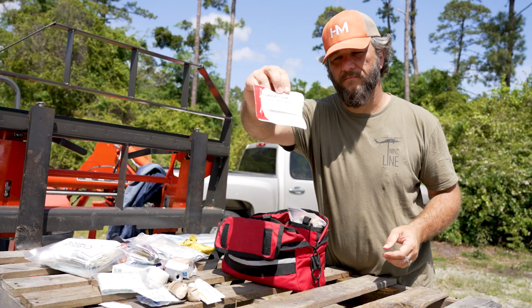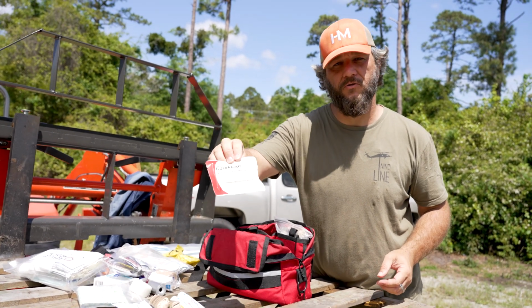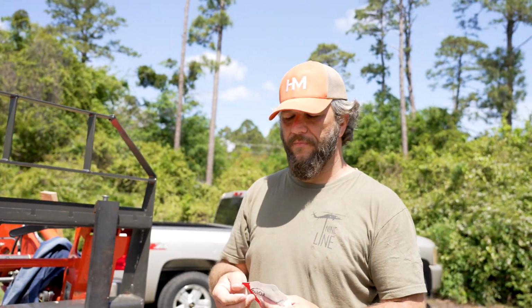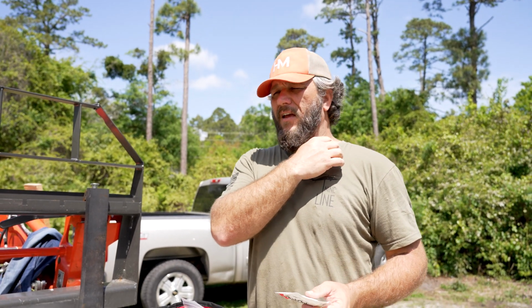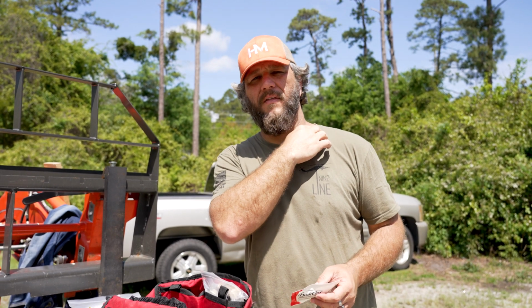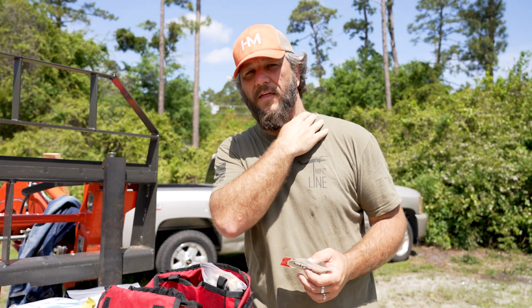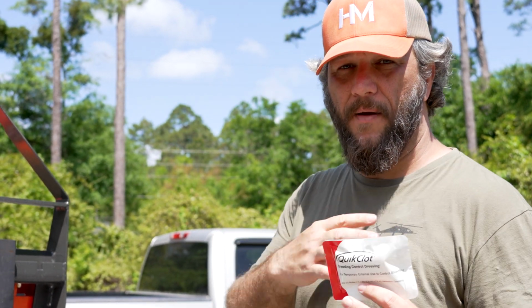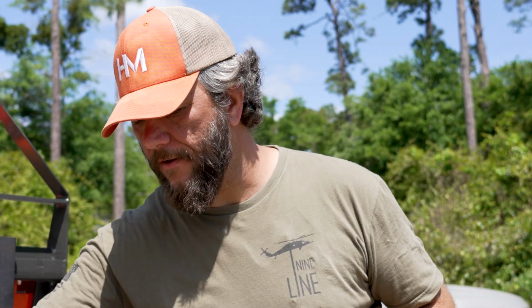QuikClot. This is bleeding control dressing. If you aren't familiar with QuikClot, basically it is an agent, if that's the right word, I don't know, that clots the blood right there at the wound. If you're bleeding, say right here at your neck, then what you would do is pack this in before you pack any regular gauze in, and it'll help clot that up and help stop the bleeding better.